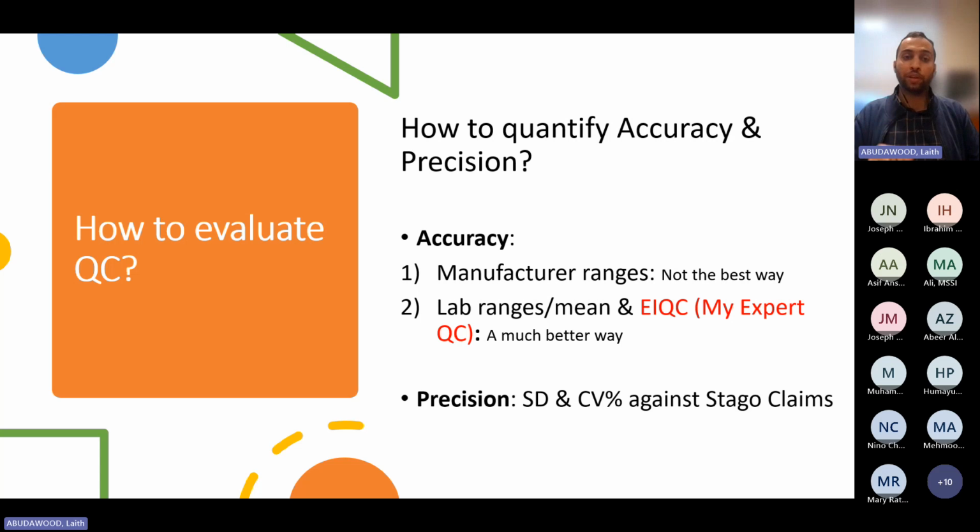Tomorrow it gives me 16 for PT. The day after it gives me 20 for PT. This is unacceptable. These are huge ranges. These are very huge. Sorry, these are huge changes. What if the same change is impacting my patient?